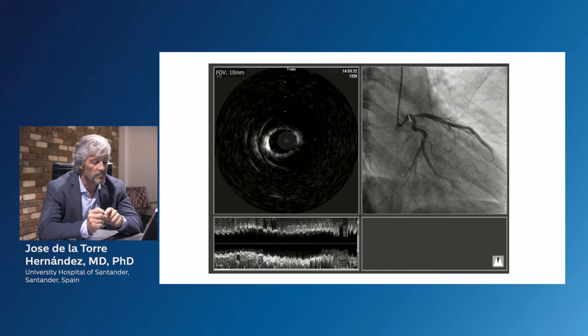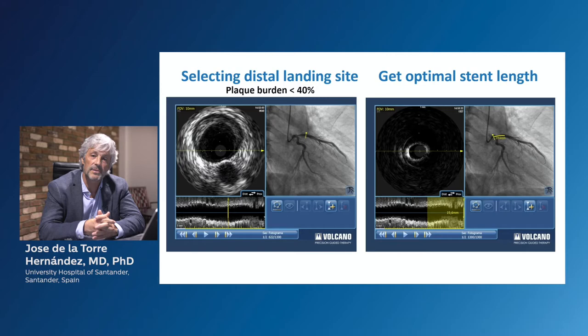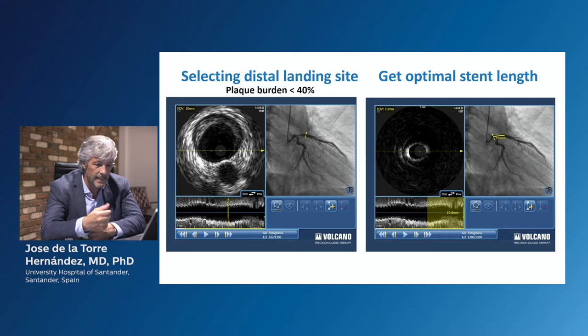In this case, we could properly select the distal landing site for the stent in a segment with less than 40% plaque burden, and determine the optimal stent length from this landing site distal to the ostium of the left main. In this case, the length was 20 millimeters.